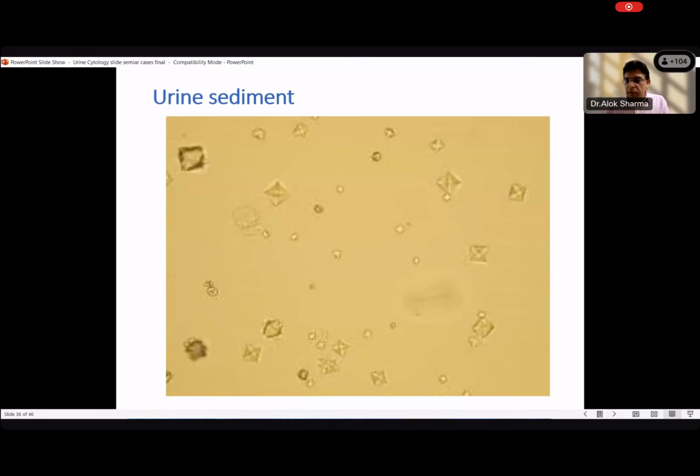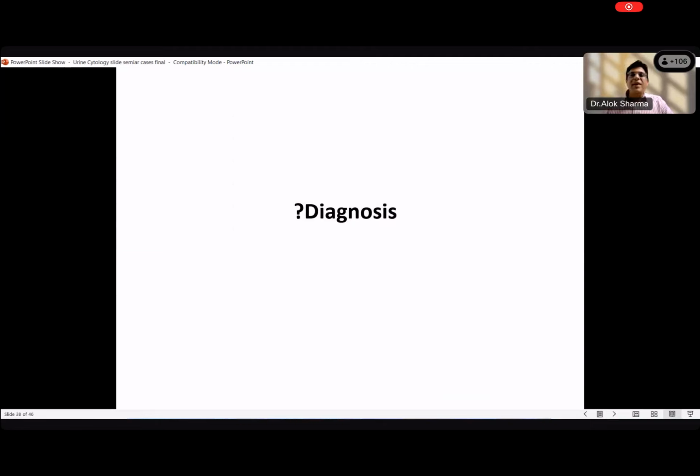I told you in the last class. So there are two types of oxalate crystals. Yeah, monohydrate and dihydrate. So which is this one? Dihydrate. Okay, fine. So they are the ones who polarize. Right? So what will be your diagnosis in this case?